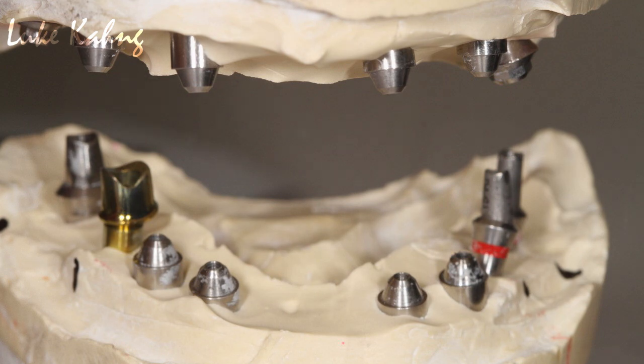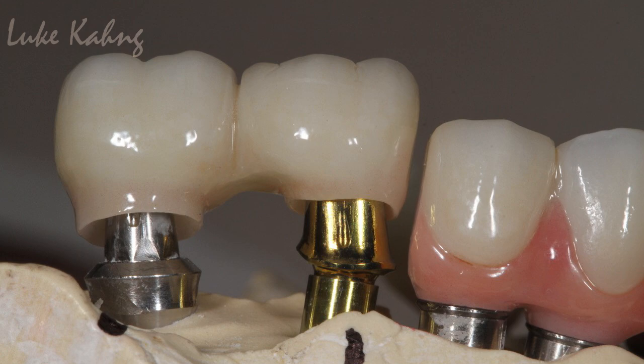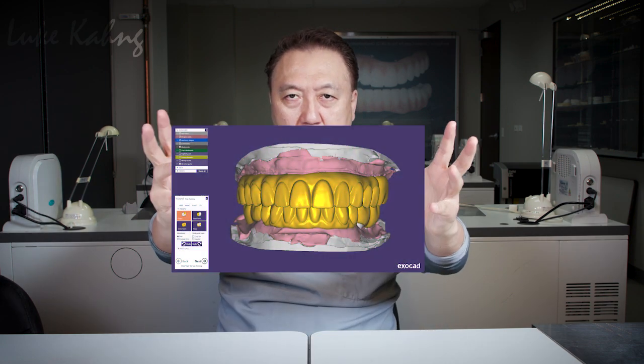Before that, we made the implant site — trying to create deep good hygiene for individual crowns and two-unit bridges with screw-retain, which is great. We made exceptional hygiene design, so we don't have any pink gum line — but here there is a nice pink tooth. So we finalized it. After the temporary, we got photos — we recommend a lot of photos: frontal photo, side photo, and occlusion photo. Then we put it into CAD, scanned and designed again, made tweaks, then milled. Milling is sometimes tough, sometimes easy. I'm glad I have so many varieties of milling machines.